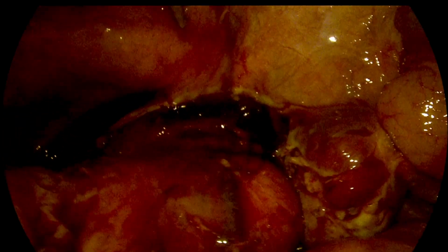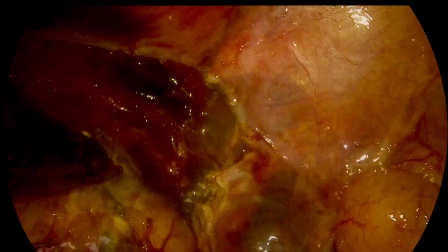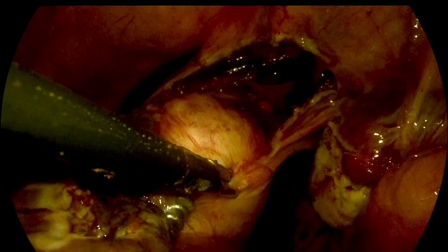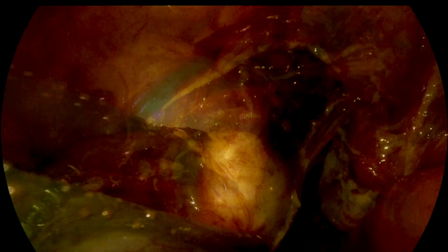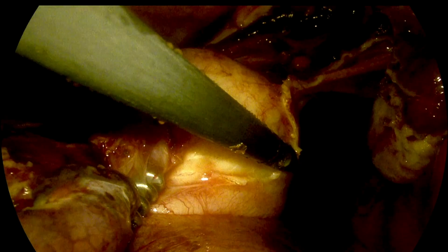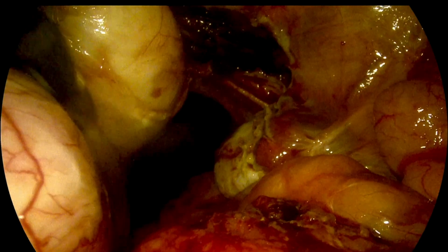Now we are into dissection on the right. On the right side, at the level of the isthmus, there is a small fibroid present. It's around a 2 by 3 centimeter fibroid, which is covering the uterine vessels. And the uterosacral ligament is pulled close to the cervix, close to the isthmus of the uterus. The uterosacral ligament is pulled up due to the small intramural fibroid at the level of the isthmus.